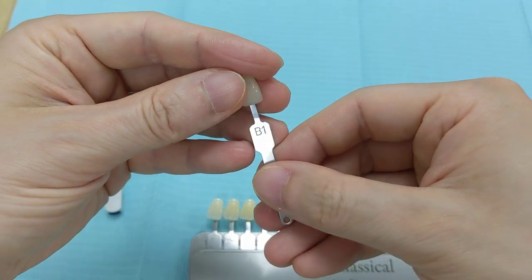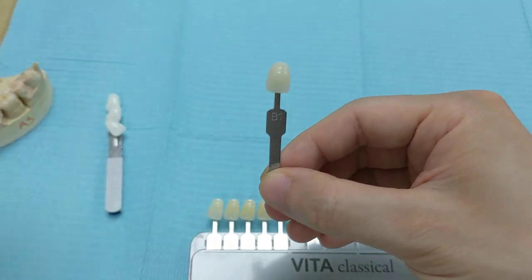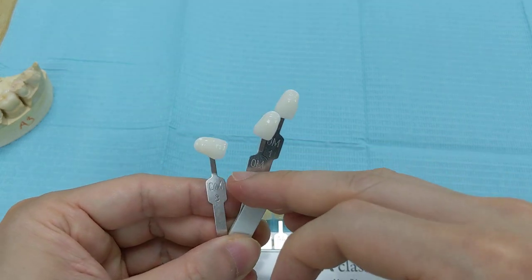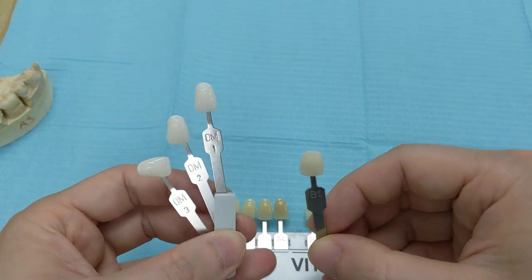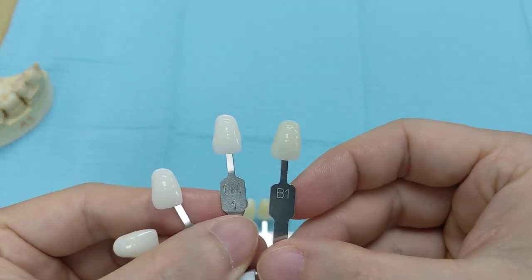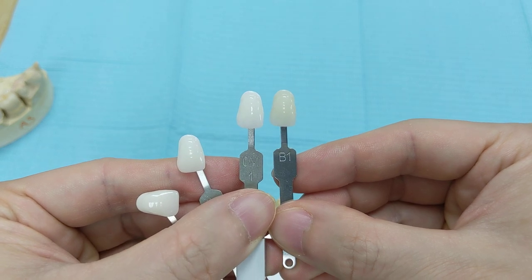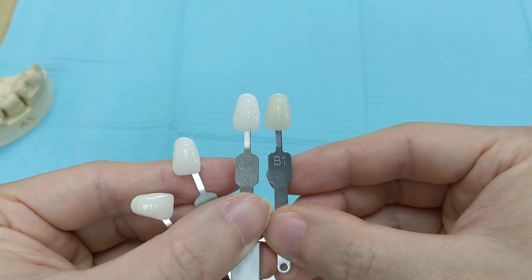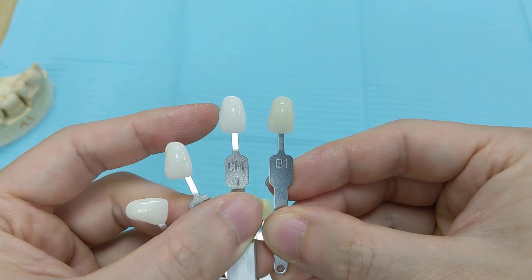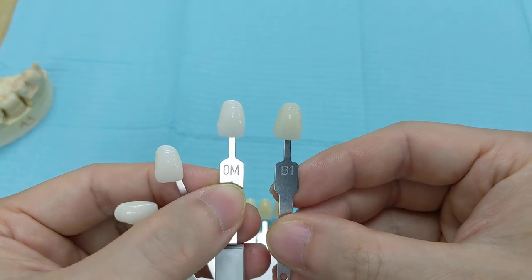So that's just to show you what B1 looks like compared to all the other natural tooth colors. But we also have the bleach colors too right here — the Hollywood whites, which are in the 0M range. The whitest one is the 0M1. Comparing B1 to 0M1, you can tell right away that the 0M1 is definitely whiter than the B1. You can see the tinge of yellow in the B1, whereas the yellow is just non-existent in the bleach shade.